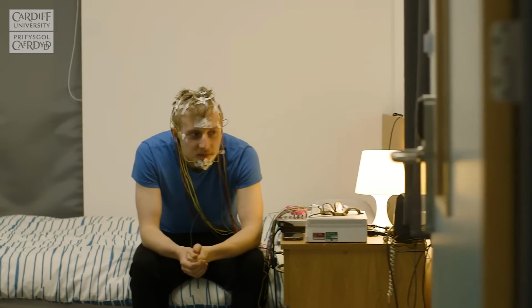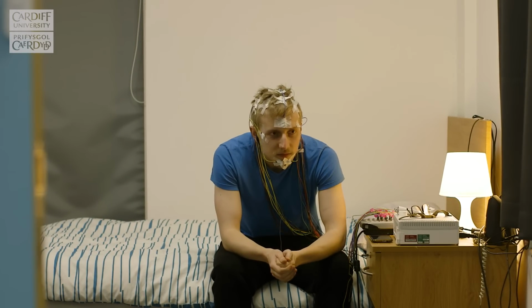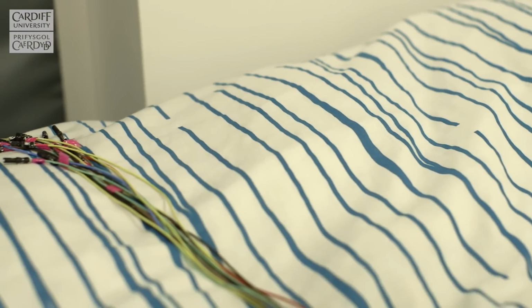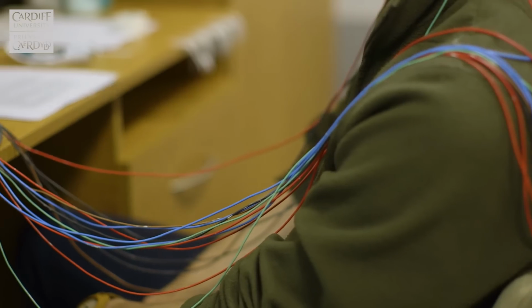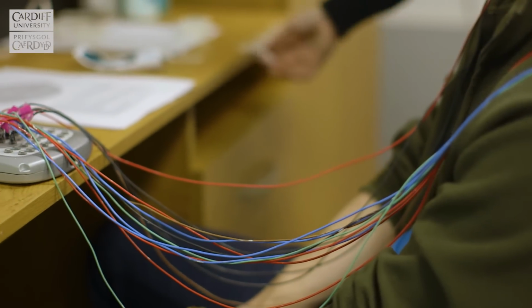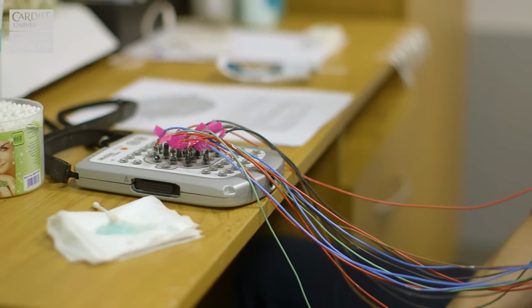In a medical setting, EEG is used to investigate a number of conditions, in particular epilepsy. One of EEG's biggest advantages is that it is extremely portable. You can bring it to the bedside, and it has the lowest equipment cost of any of the techniques described here.